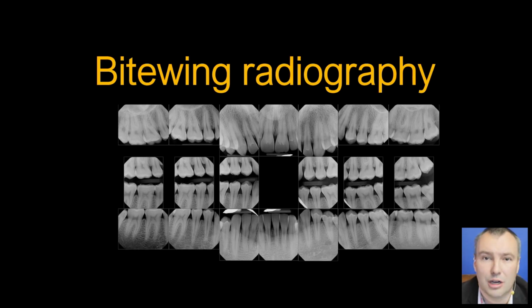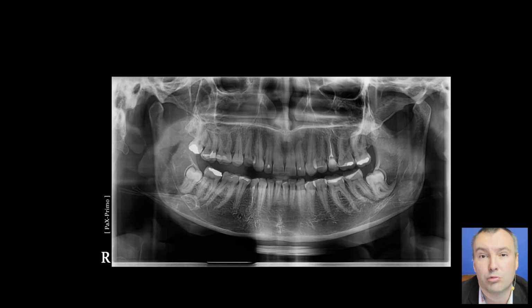Also, it is quite difficult with bite-wing radiography, because to make sure that we check everything, we need like 8 different images, which is really a lot for the patient. We could think of pantomography, but we know pantomography is most of the time useless when we think of the interproximal area of teeth, because of the overlapping of the teeth and also some changes in patient position. None of this is 100% foolproof.